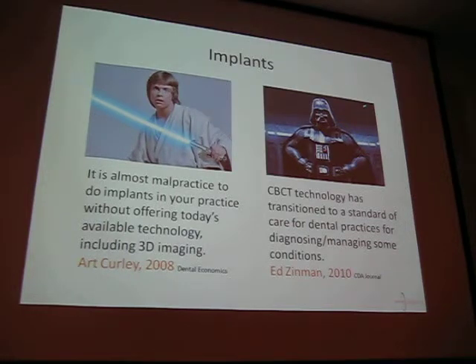You're a little more scared of Ed. And 4 years ago, he wrote in CDA, hey, CBCT technology has transitioned to a standard of care for dental practices for diagnosing and managing some conditions. No one's going to say you have to use it. It's not the law. But the law is whatever is the standard. And the standard is whatever is known and easily accessible.